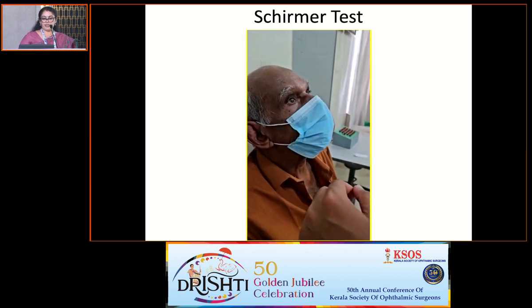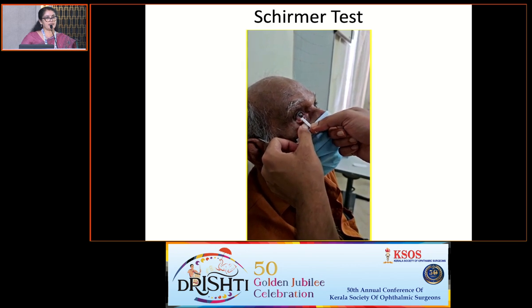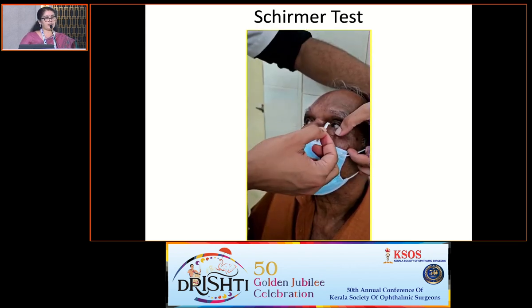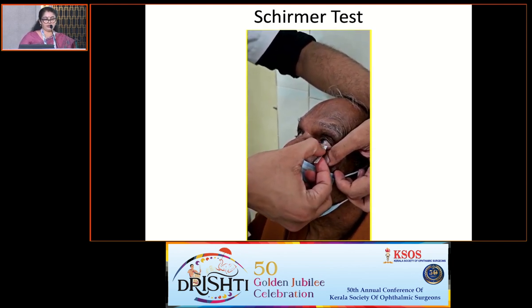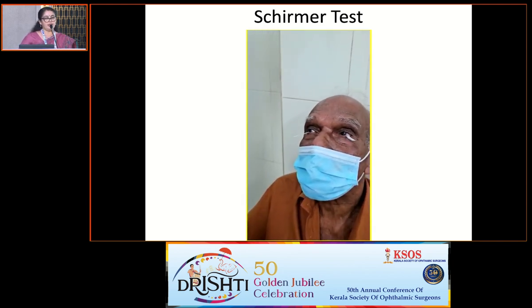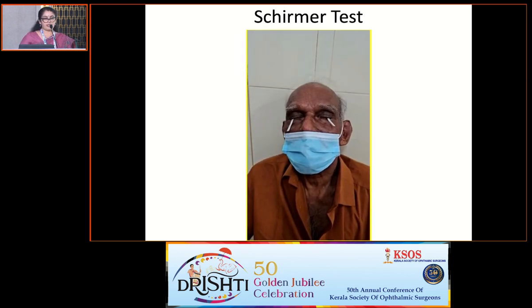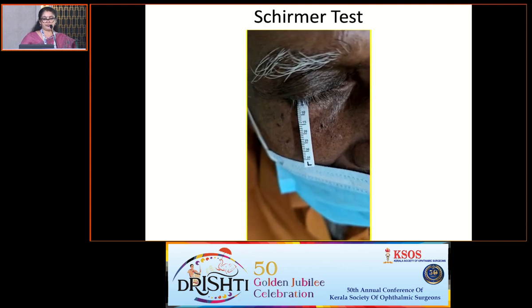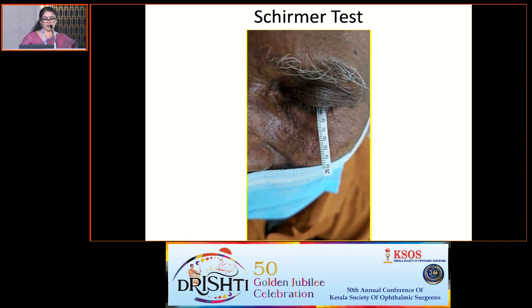There should be good patient communication because it is quite an uncomfortable test and it does last for around 5 minutes. So without touching the cornea or touching the conjunctiva, it has to be inserted between the lateral 1/3 and medial 2/3. The patient has to be very comfortably seated with the head resting. The patient can open or close. The recent consensus is the patient can gently close his eyes for 5 minutes without the air condition or the fan, that you all should remember.